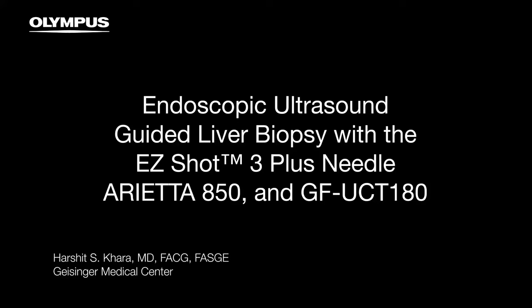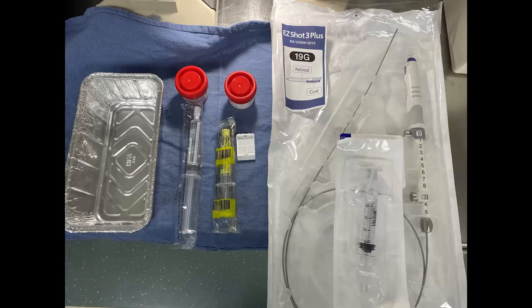Endoscopic ultrasound guided liver biopsy is performed using the Olympus Areata 850 EUS processor along with a linear echo endoscope and the EasyShot 3 plus 19 gauge needle.